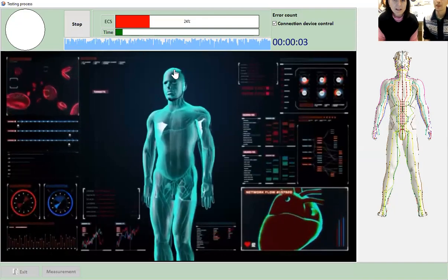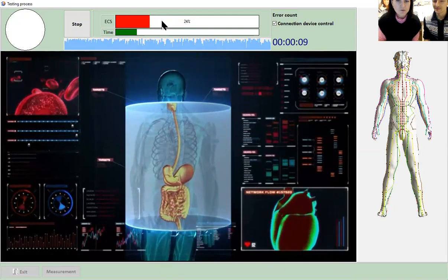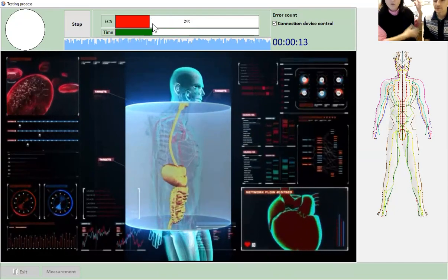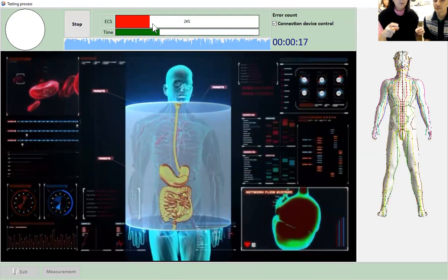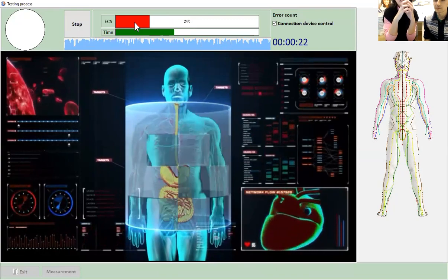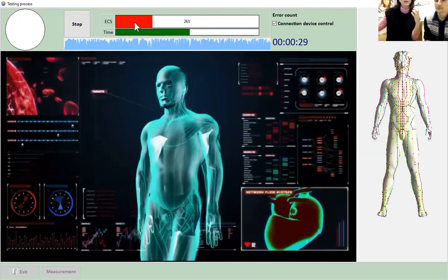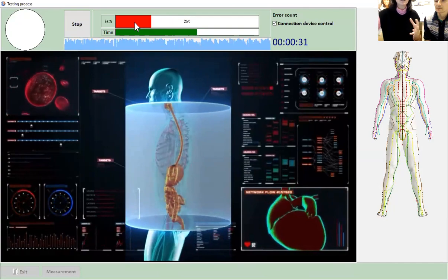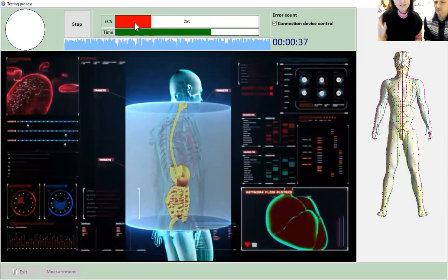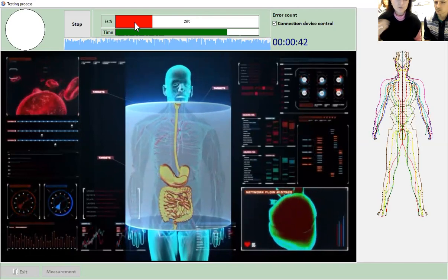So again, explaining about this red bar, the one that shows right now 24%. This is the production of the energy that goes around in his body. If it is lower than 15 or so, the body is greedy, so it won't share the energy. And basically, if the body cannot share energy, it cannot take it either. And if it's over 65, 70%, it's too much. So the body is working too fast.